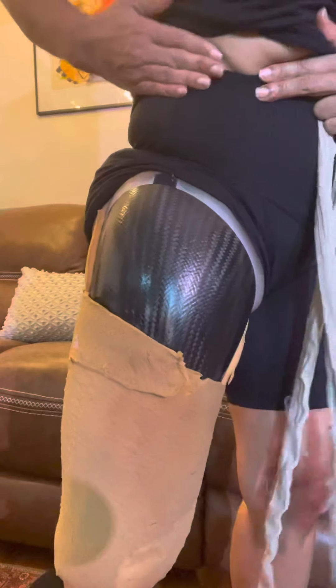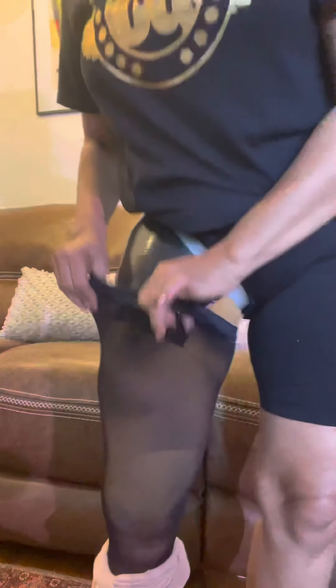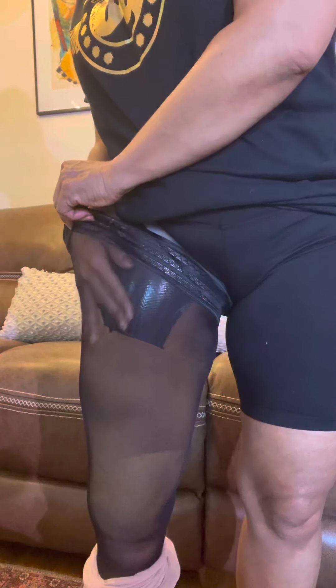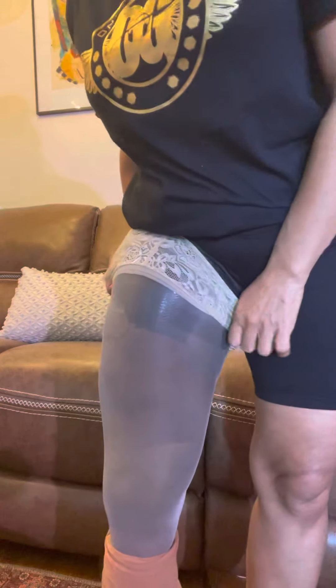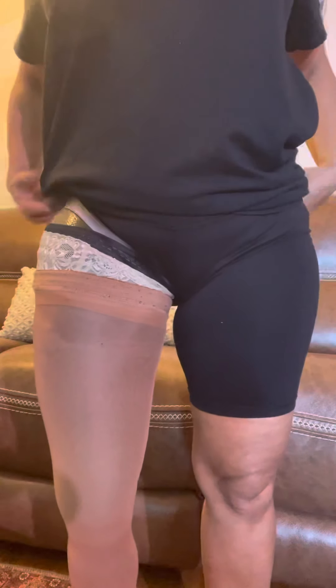I pull up my three layers of thigh highs. I use these because in the sun, if you don't have the black one on, you can see all the mechanics of your leg. Then I pull out my next layer — this is the shadow color — and then I pull up the cosmetic cover that I get from the prosthetic place. Then pull your shorts down like that.